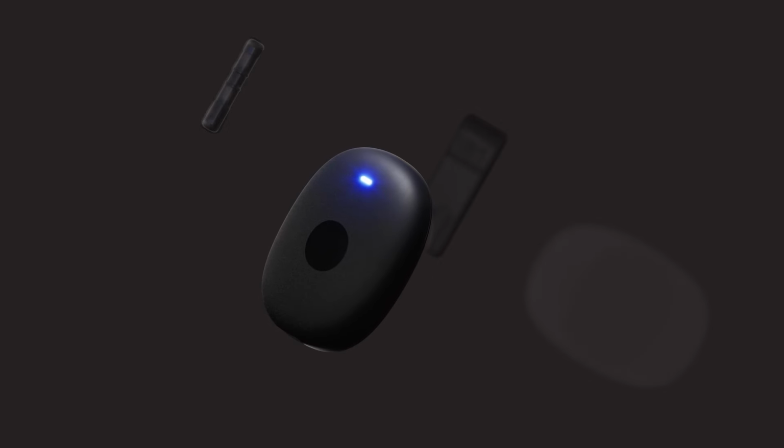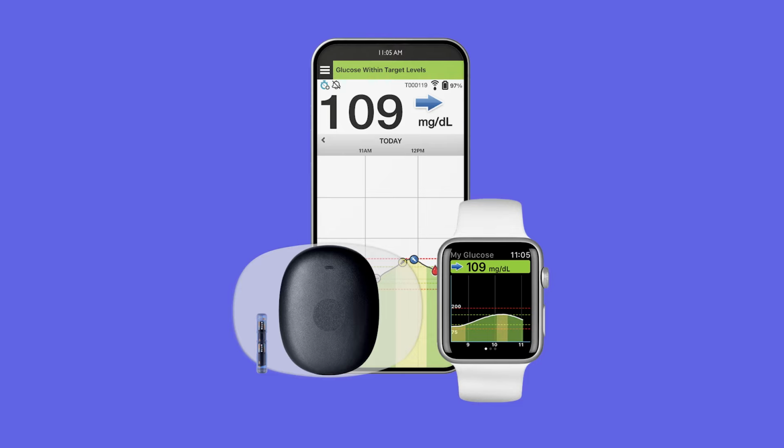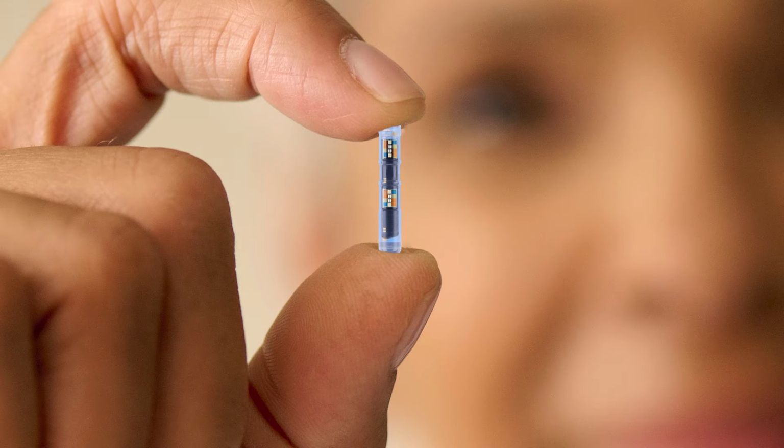In all honesty, now that we have the 365-day product, we are now exclusively focused on completely eliminating the transmitter. Yes, we could make it smaller, but frankly, we're going to put our resources into getting rid of that transmitter. And it does two things today. It powers the sensor and it talks by Bluetooth. So that powering is now going to go inside the sensor, and the Bluetooth is now going to go inside the sensor. So I don't think it makes sense for us to fight to take the transmitter size down, because in the same amount of development time, we're going to eliminate it.